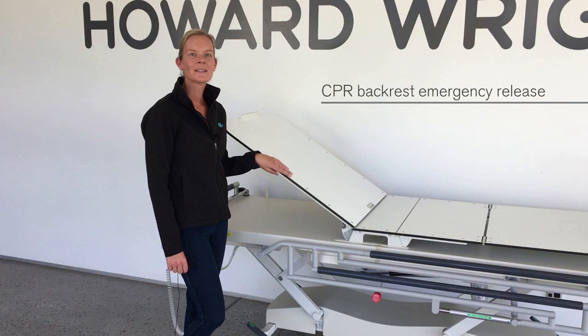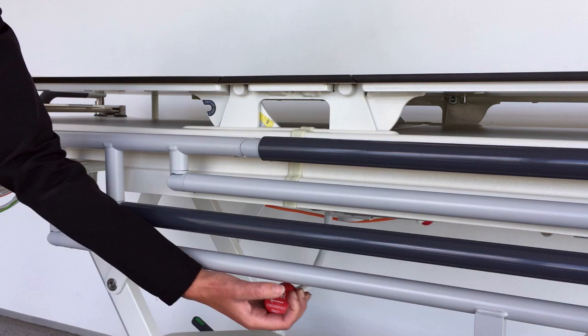A CPR backrest emergency release lever is located on either side of the stretcher. To lower the backrest quickly in an emergency, move the lever towards the head end of the stretcher and the backrest will lower.